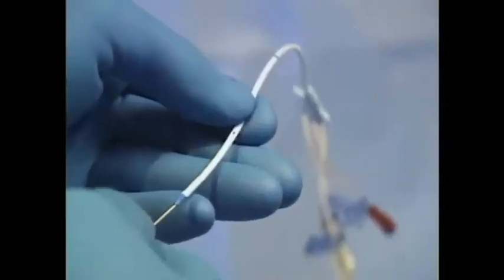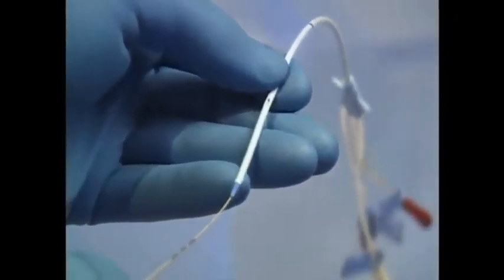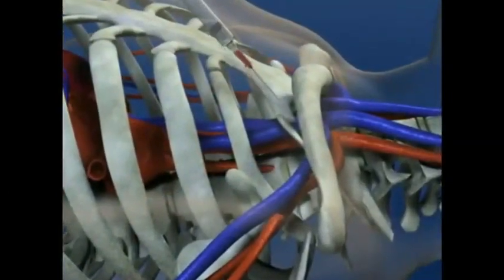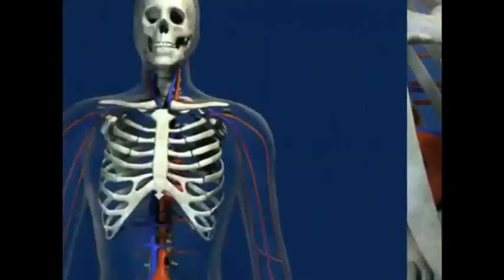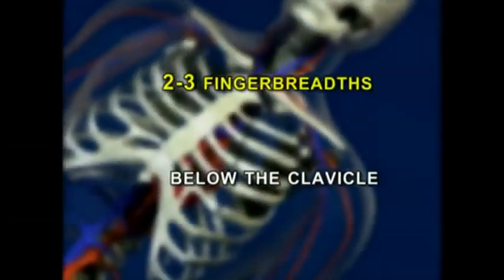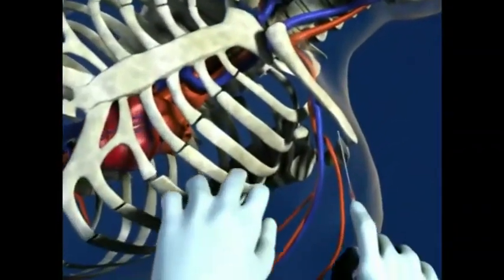The modified Seldinger technique, threading the catheter over a guide wire, is used in almost all central venous catheter insertions. Again noting the insertion landmarks, the area of insertion is anesthetized at the skin level, and if possible, the deep subcutaneous area and the periosteum of the clavicle are anesthetized as well. The introducer needle is inserted 2 to 3 finger breadths below the clavicle at the previously identified insertion site. The needle is not aimed posteriorly.